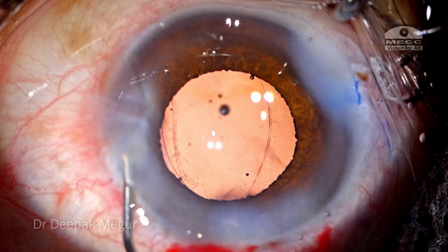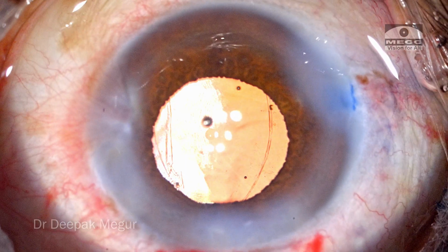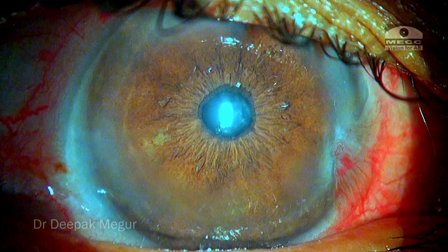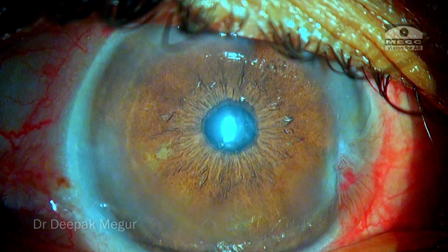The side ports are hydrated, intracameral antibiotics are placed, and that's it, the case is done. So these are the first day post-op pictures, and the patient was doing well and continues to do well after a month and a half.